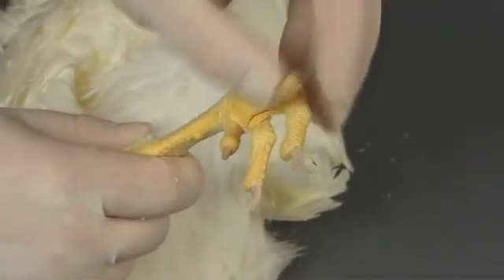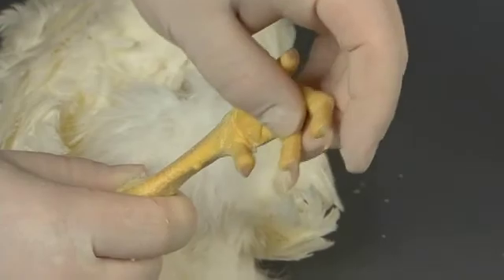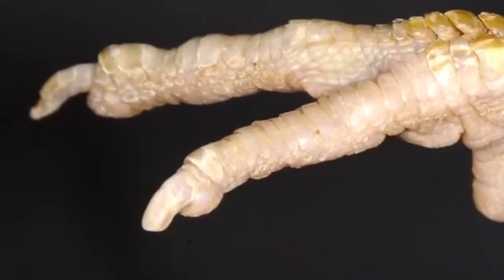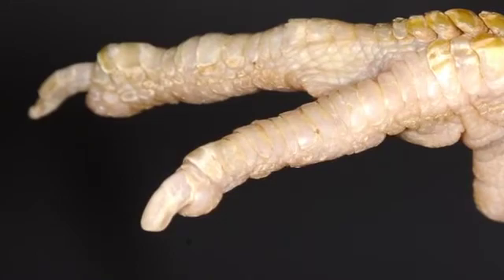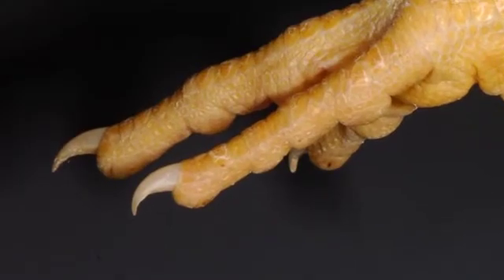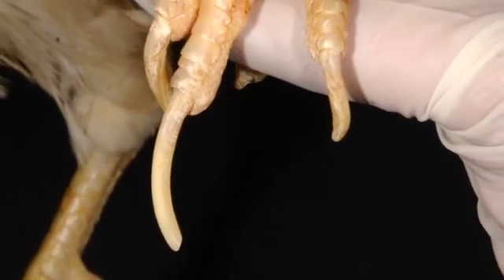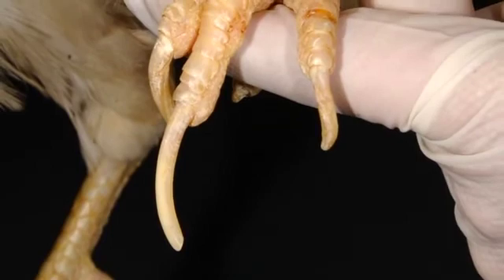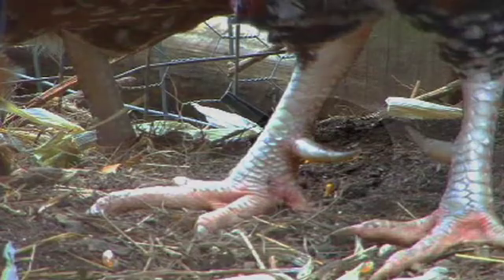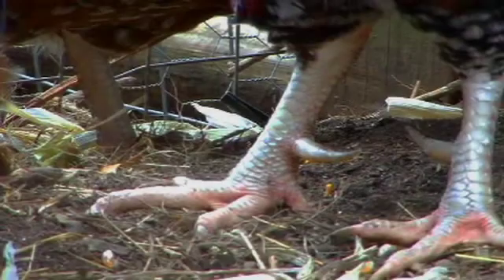Finally, examine the feet. Bird claws will vary depending on housing conditions. In birds housed on the floor, claws will normally come to a blunt, tapered end. Birds in cages may have sharp claws. However, the claws should not curl back on themselves or fray easily, which may indicate a nutritional imbalance. Mature males of some species have a spur, while the spur on the female is much smaller. Sometimes the spur is removed on males to prevent trauma to other birds in the facility.